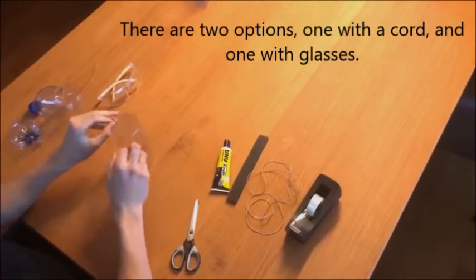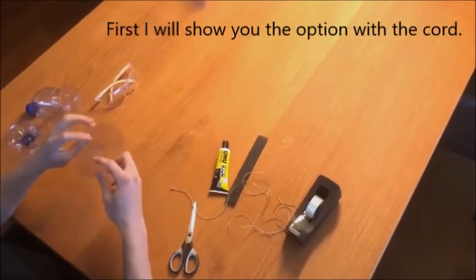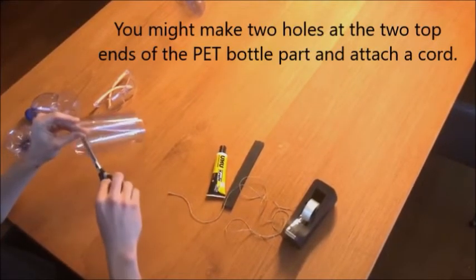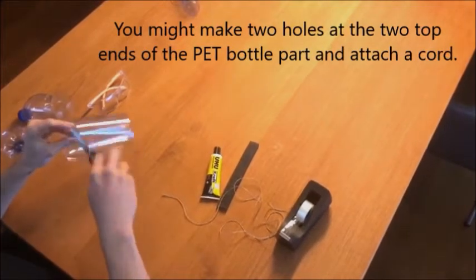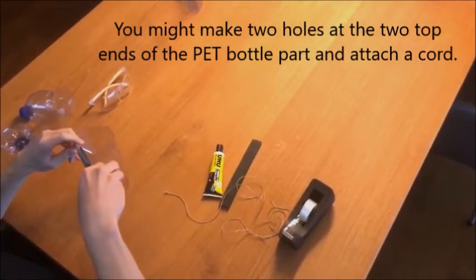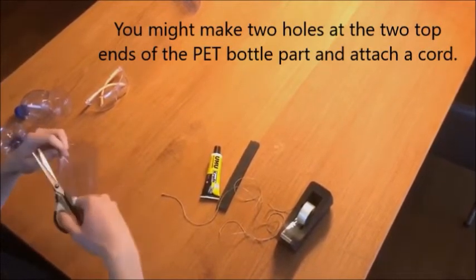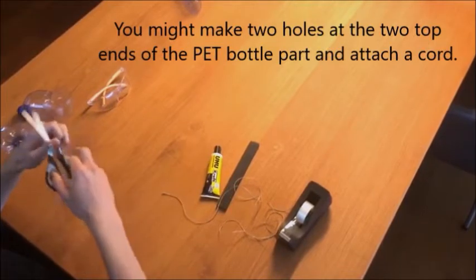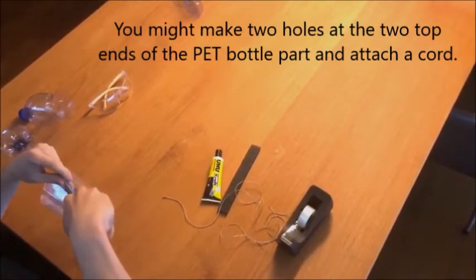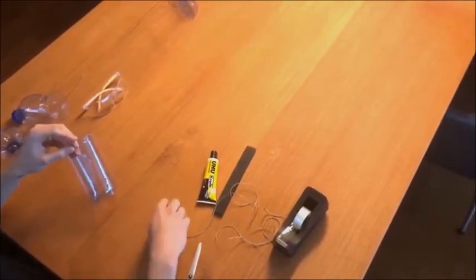Now it depends if you use the cord option or the sunglasses option. First I'll show you how to use it with the cord. You have to make two holes or two cuts in both corners at the top like this, and run the cord through it.